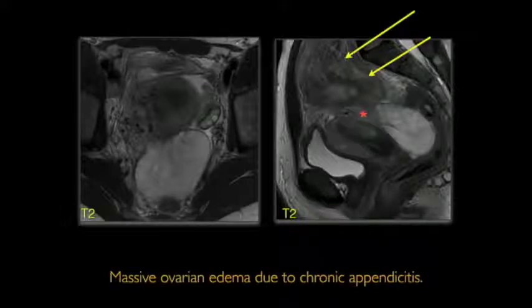We did see the ovarian edema, but what we found was a subacute appendicitis. The appendix had been inflamed and was dripping down to the ovarian pedicle and basically caused it to become edematous and twist off the lymphatics and the veins. Obviously, a totally unusual case, but it happens. So they went back in, did the surgery with the general surgeons and GYNs, and they managed the ovary expectantly because once the inflammation went away, the ovary size decreased.